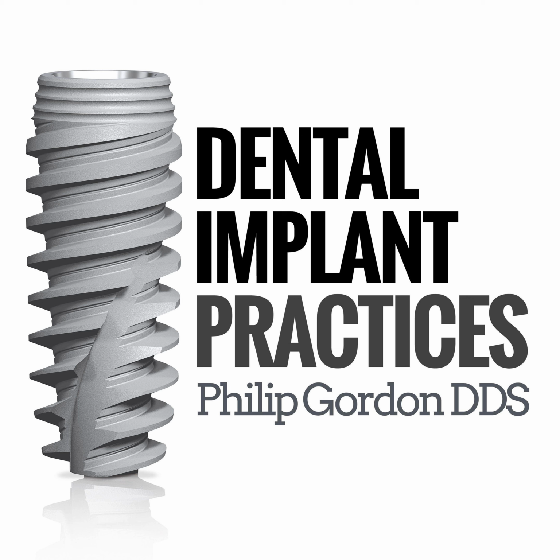Or, if they need bone, if their ridge is narrow or the ridge is atrophic, they see that at the consultation. And so when I'm explaining to them, we can place implants here, but the ridge is kind of atrophic. We could maybe get in some 8-millimeter implants, but we like to get in longer implants. We'd like to really put in 11-millimeter implants. That's going to give us more long-term stability. So we would need to do some bone grafting, and we show them on the scan why.